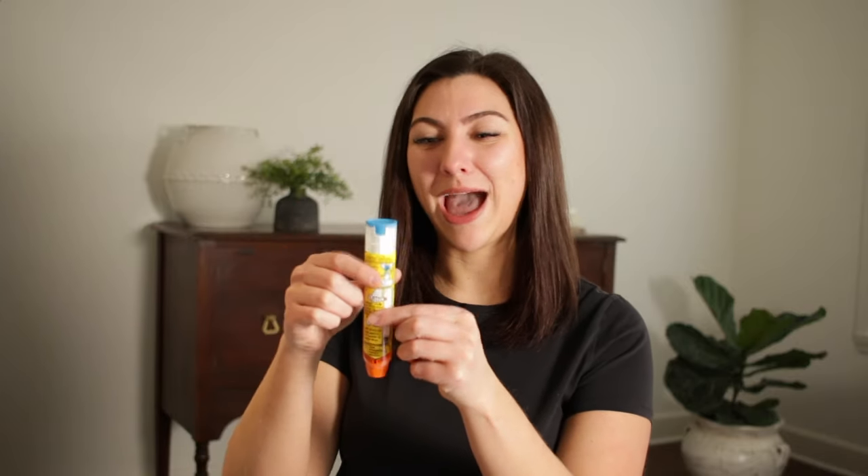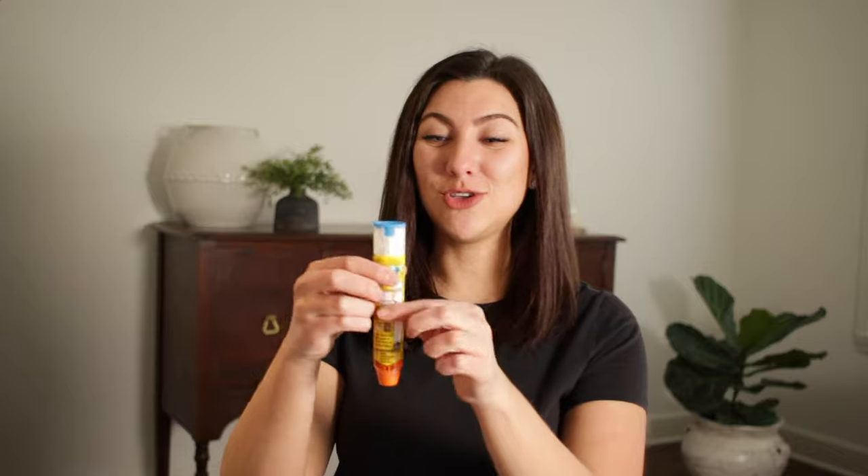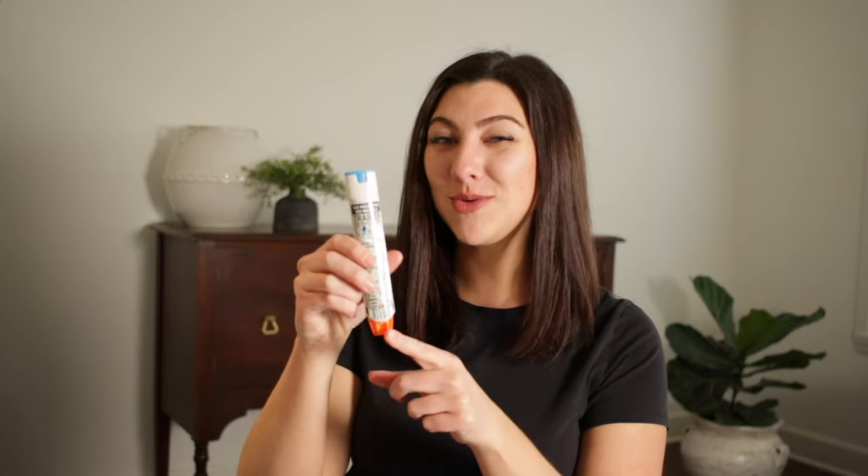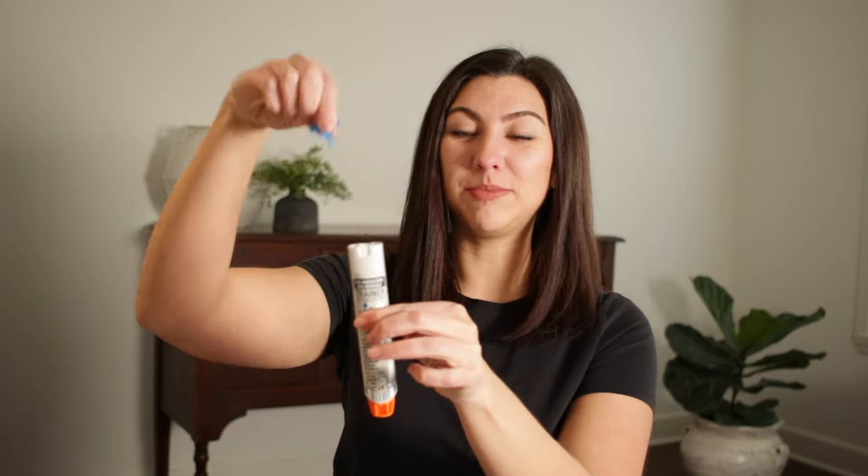Let's talk about how the EpiPen works — it is really simple. The EpiPen comes in a plastic container. To open it, you simply flip up the top cap. There's really only one more step: removing the blue cap at the top. This is a safety feature to make sure the EpiPen doesn't accidentally discharge. To demonstrate, I'm going to use our trainer EpiPen, which looks almost exactly the same but has no needle and no medication inside. To use it, we simply remove the top blue safety piece.